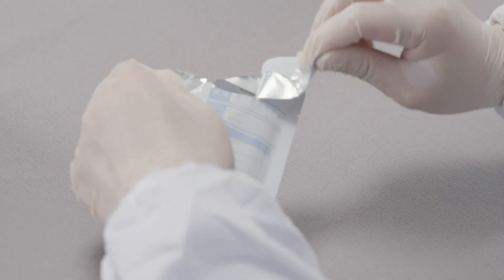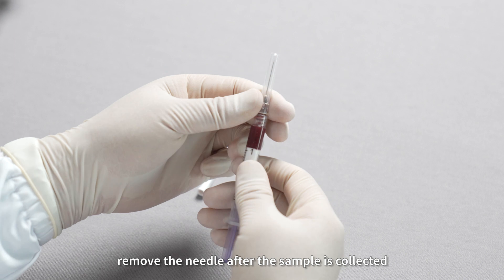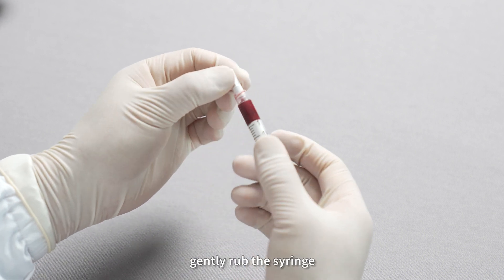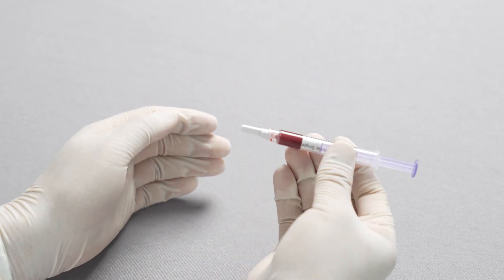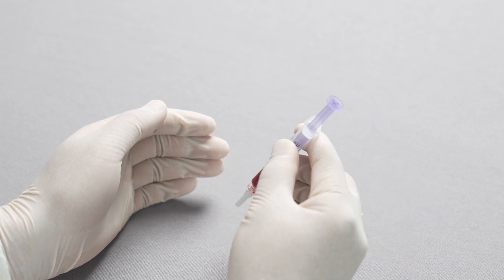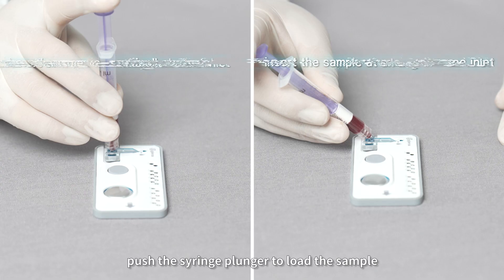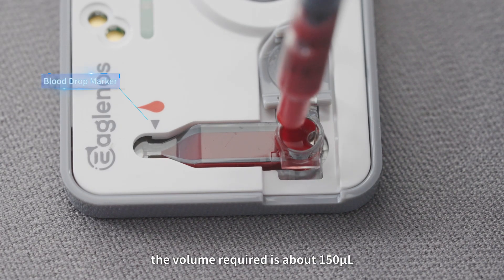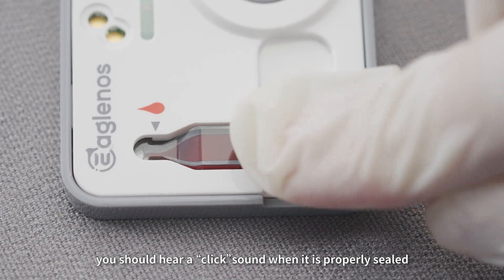Step 3: Sample Loading. Remove the test cartridge from the package. Remove the needle after the sample is collected. Seal the syringe with a sealing cap. Gently rub the syringe and invert it several times to mix the sample thoroughly. Discard the first two drops of blood before loading the sample. Push the syringe plunger to load the sample into the blood drop maker. The volume required is about 150 microliters. Tighten the cap — you should hear a click sound when it is properly sealed.